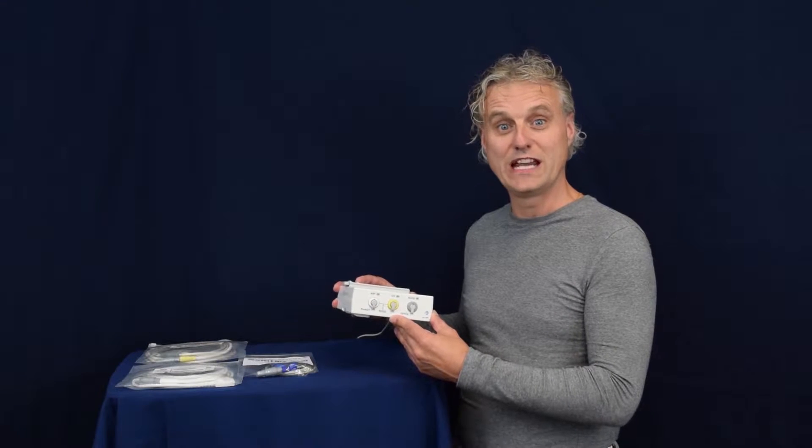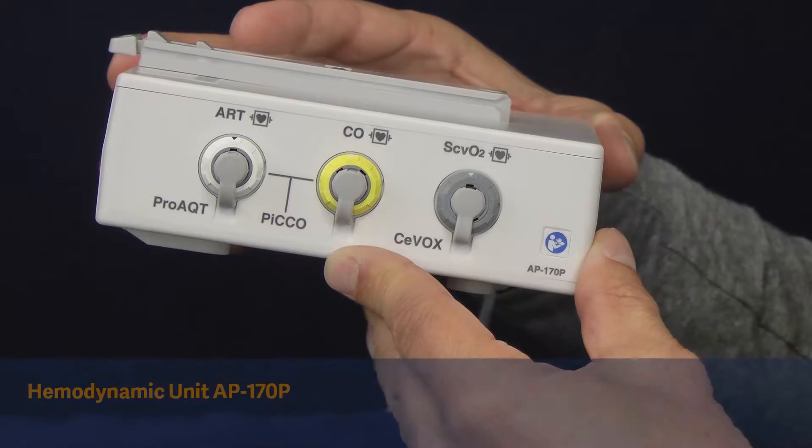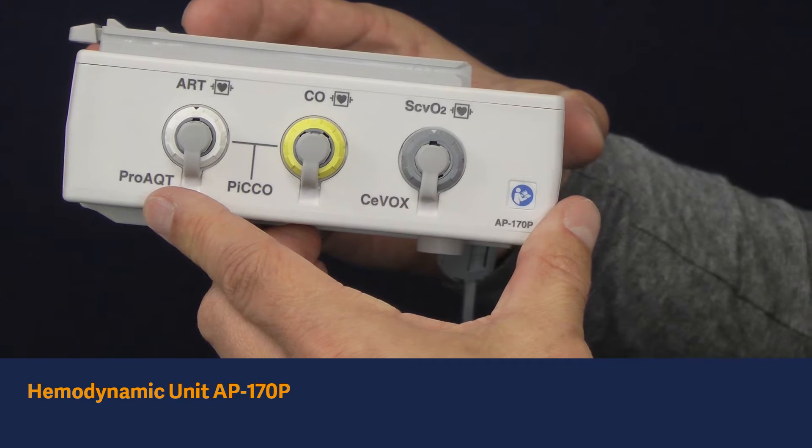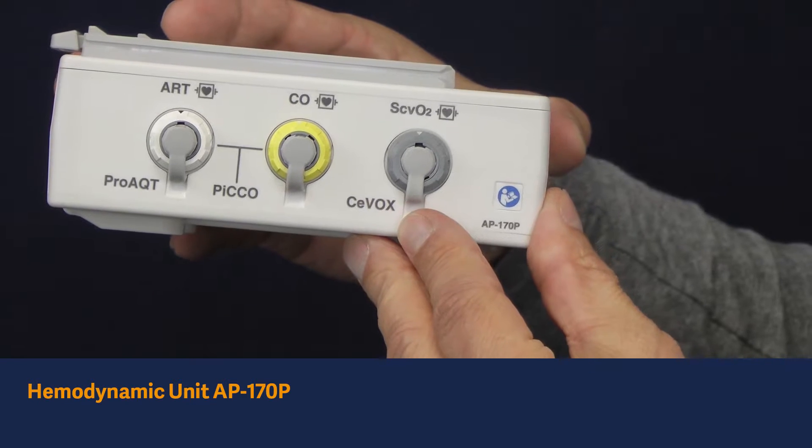Let's have a closer look at the hemodynamic unit. The following technologies are integrated in this unit: the ProAQT technology, the PiCCO technology, and the CeVOX technology.